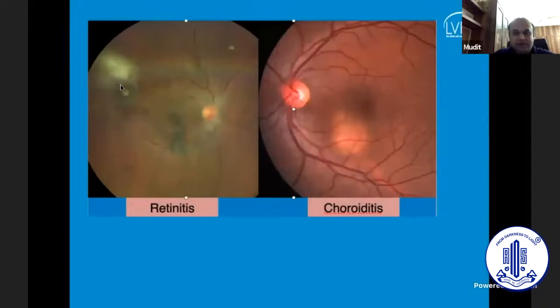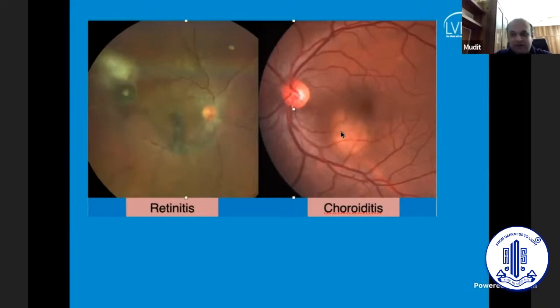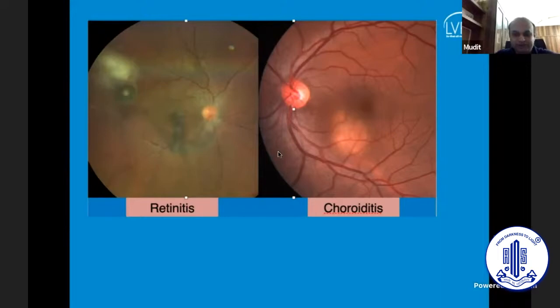For example, if you see a superficial lesion, the underlying vessels over here are obscured. Compared to that, you see a deeper lesion and you can identify the blood vessels moving or passing over this lesion. So that is a deeper choroidal lesion over here.